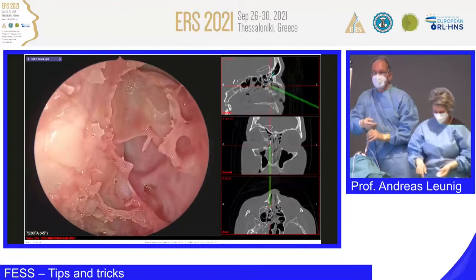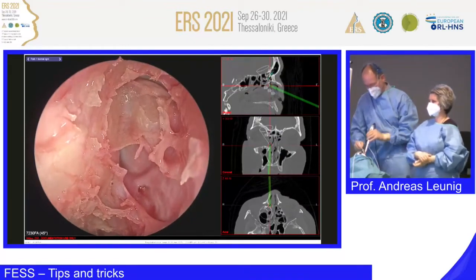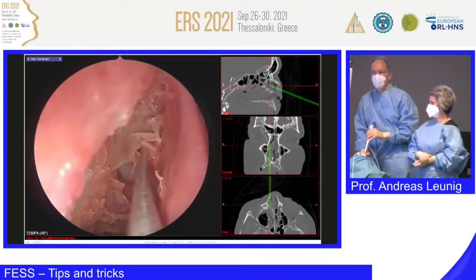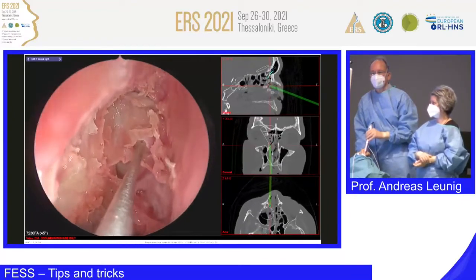Now I want to remove a little bit more of the bone up there, and then we show you a type 2 approach to the frontal sinus. You see here, we can dissect a little bit more.